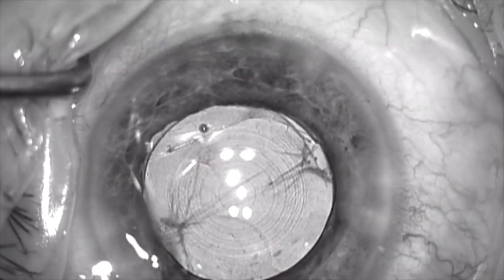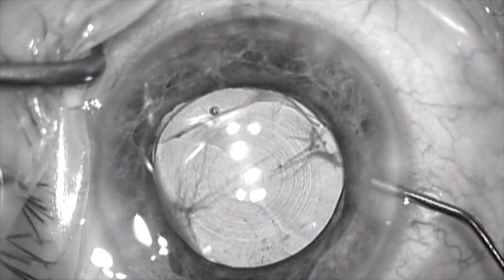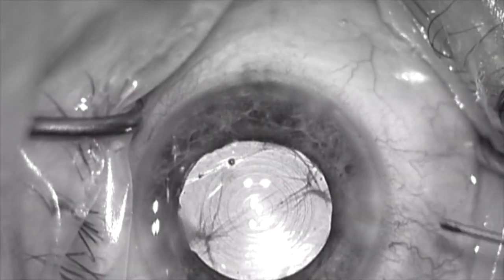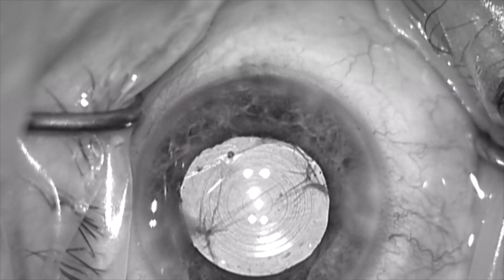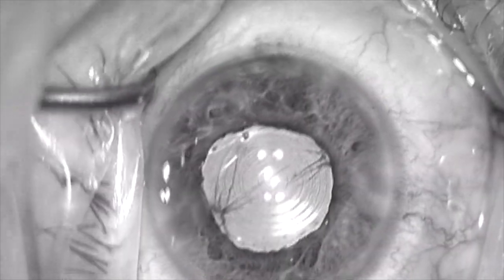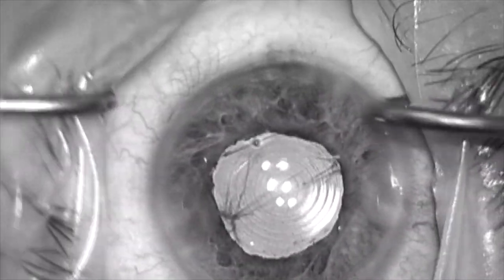I'm injecting miostat, which will bring the pupil down. The lens feels centered and secure and the case is completed. The next day in the office at the slit lamp, the lens appears to be well centered. The yellow arrow shows the anterior capsule — the lens is clearly under that. This view on the temporal side shows that the lens is under the anterior capsule rim, shown with the yellow arrows. Thank you for your attention.